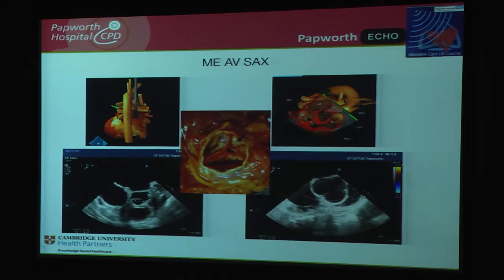The picture on the right is where the aortic valve is not opening. Any reasons why? The patient's on some kind of mechanical cardiovascular support. Okay, so that's one. And if you see the 3 leaflets, the leaflet that's closest to your probe is usually the non-coronary. The leaflet in association with the right ventricle is usually the right coronary, and the leaflet which is left is the left coronary leaflet.